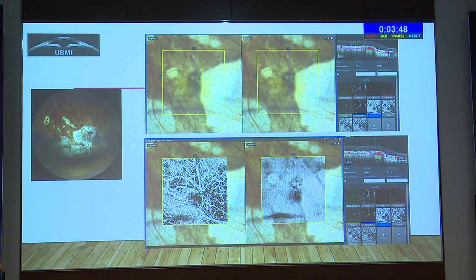So this is a case of very high myopia, a myopic fundus, and a suspected CNVM. Now, if you look at the fundus itself, it looks like it, but we are not very sure. It was a posterior staphyloma with an axial length of around 32, 33 or so. Then we did the OCTA over here, and in that particular area I could see the CNVM.